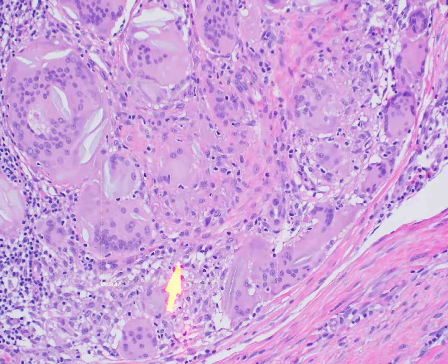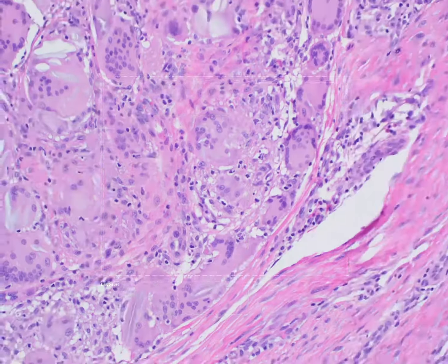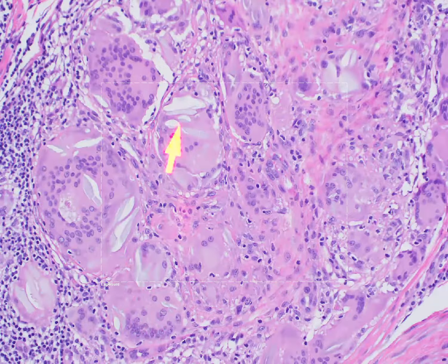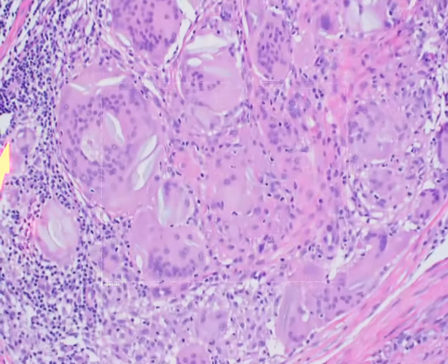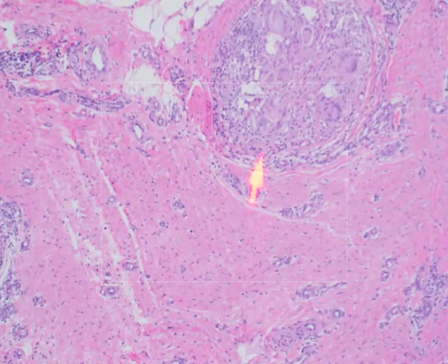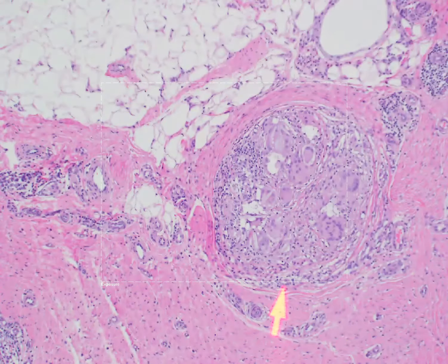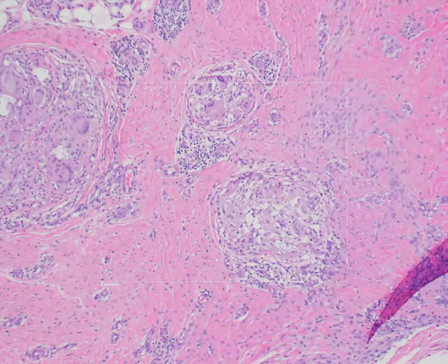These are called foreign body multinucleated giant cells. This is all degenerative suture material that's being engulfed and broken down, and you can see the rim of lymphocytes at the periphery of this foreign body granuloma. As you look throughout the tissue, you see these granulomas of varying sizes as well. So that's another example of the granulomatous reaction pattern.